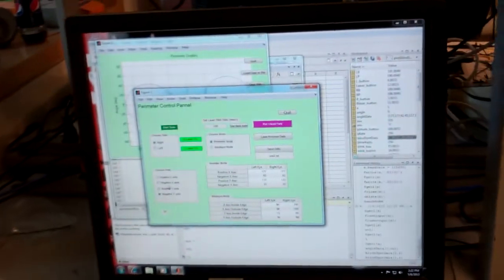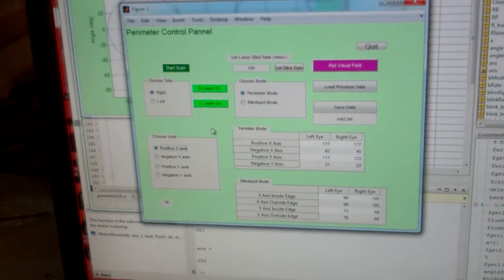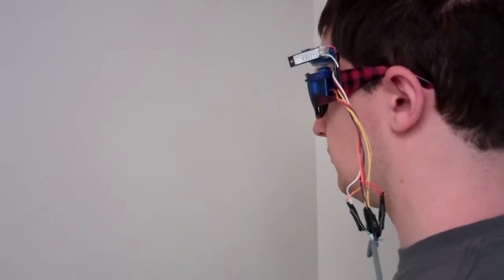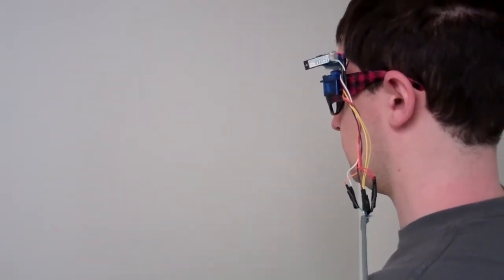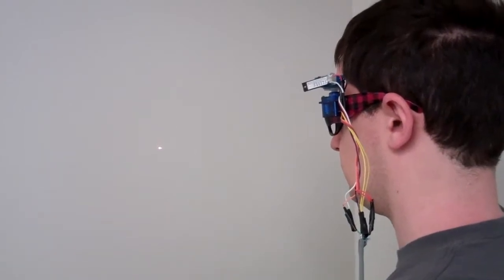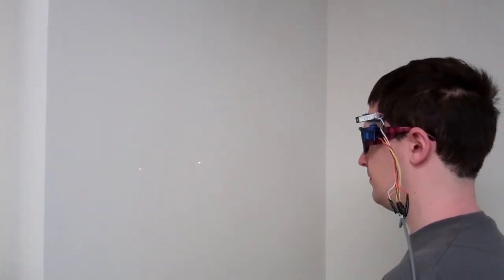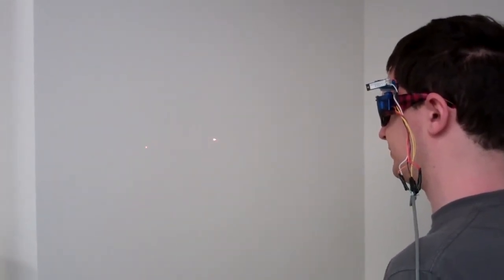Starting in perimeter mode with the right eye, we're going to scan along the positive x-axis. One laser is focused right in front of the right eye while the other scans outwards toward the outside edge of the field of view. The lasers are on now — only one of them is blinking, and it should be the right one.